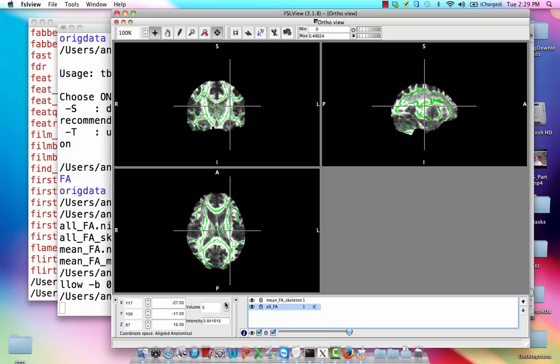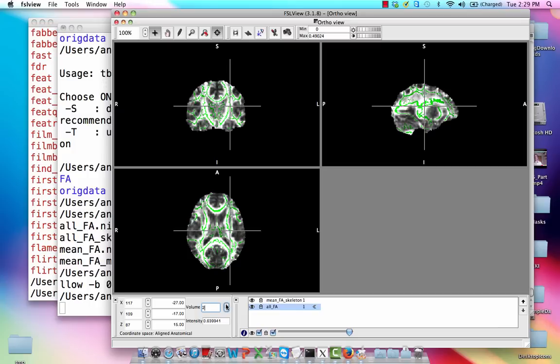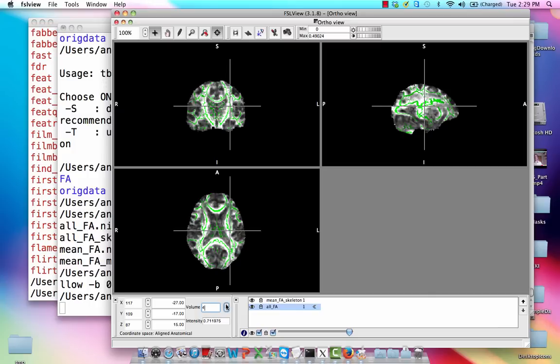It's traced out a good representation of where these white matter tracks are. If I highlight all FA, notice volume 0 is the first subject in that. So as I click through it, I'm going to be seeing how does it overlay on top of each of my subjects.